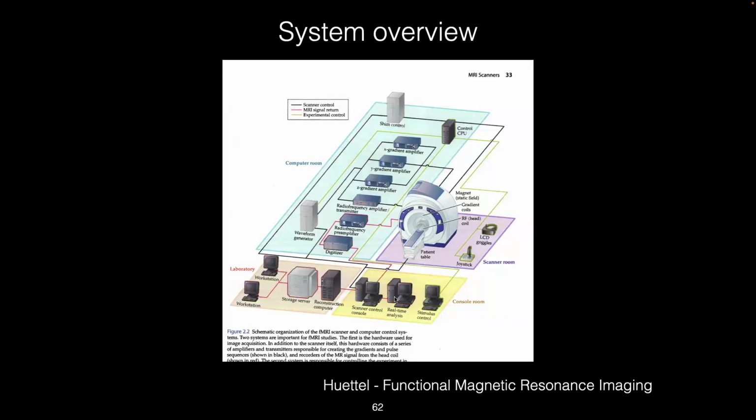We interact with all of this from the control room, where we can talk to our subjects, we can run our experiments, and then finally all of this data gets sent. Here it's going directly off to your lab's machines. We have some relay machines in the middle that we tend to aggregate our data onto to make it a little bit easier for folks to collect that data.